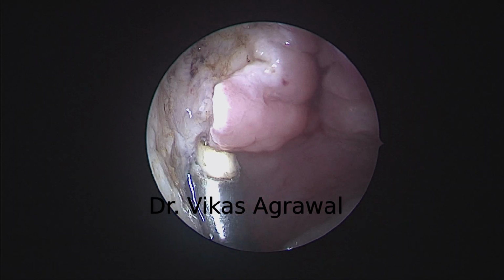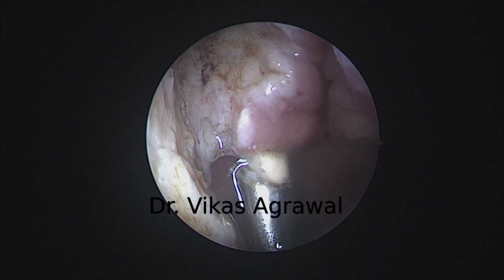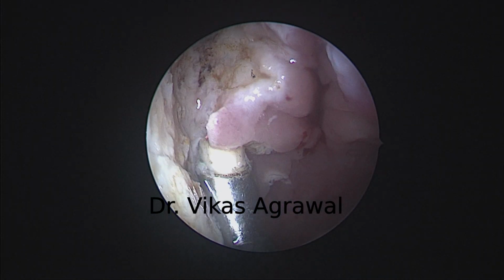Alright, now the inferior boundary will be the Passavant's ridge. You can already see that the adenoids are ending over here.